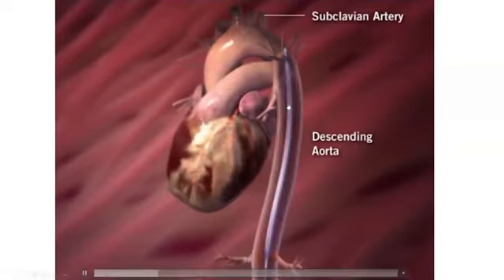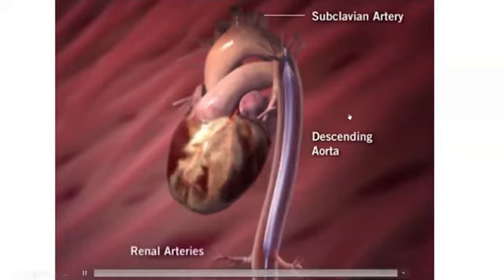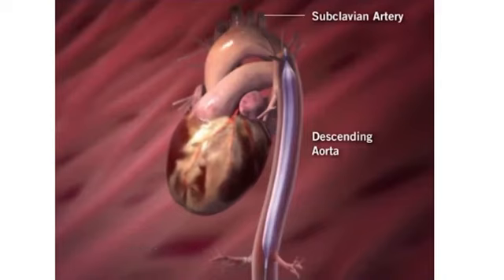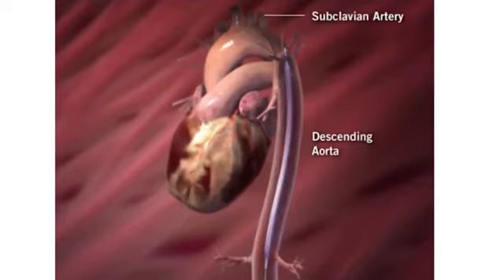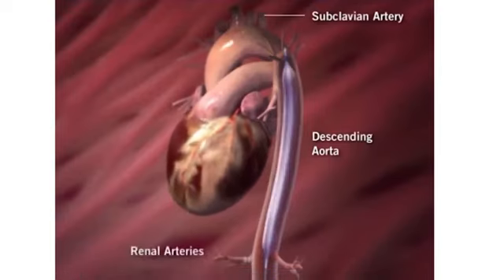This deflation is the most important aspect of balloon pump, as it creates a vacuum that reduces the pressure afterload on the left ventricle. In fact, the failing left ventricle is extremely sensitive to afterload, more so than the normal left ventricle. So the decrease in pressure afterload will allow an increase in the ejection stroke volume of the left ventricle and will reduce oxygen demands.